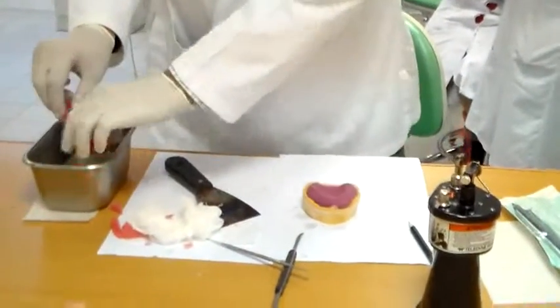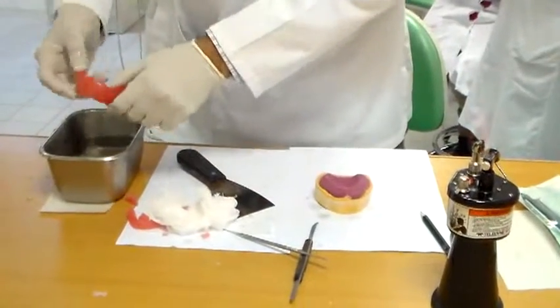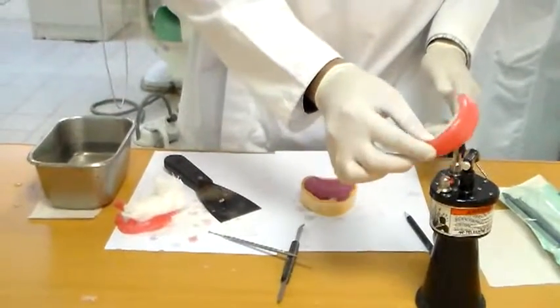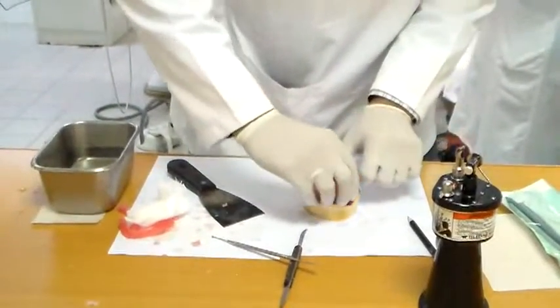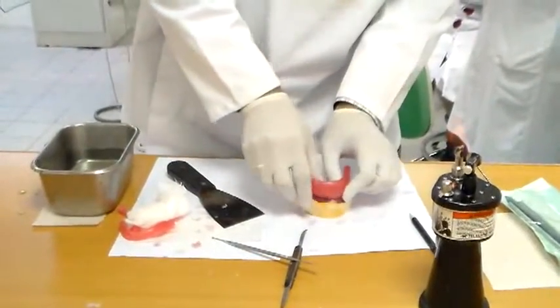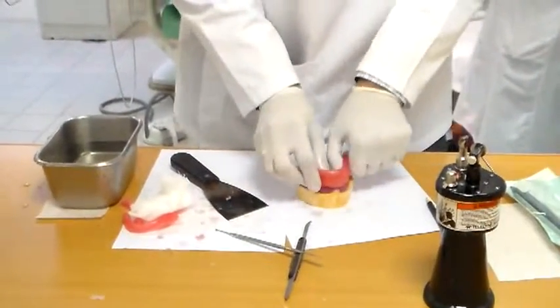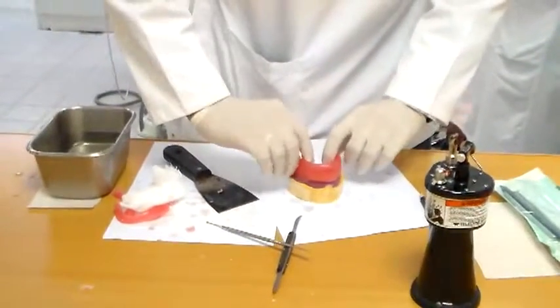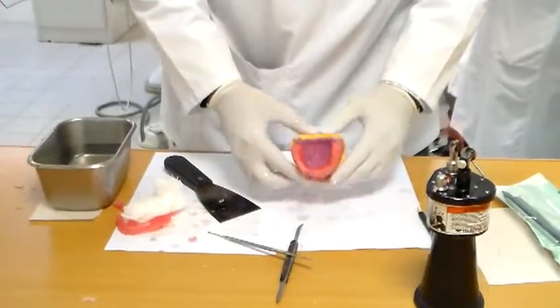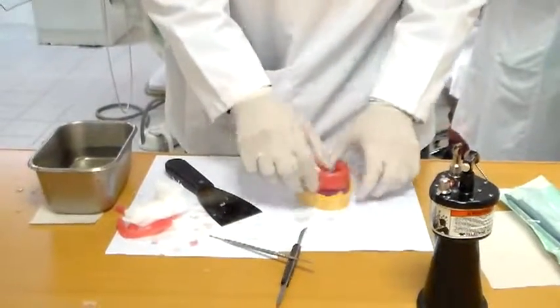Okay, so I have my occlusal rim reasonably softened out. Dry up the base, flame it a little bit, and adapt it to the anterior portion, to the outside part of the record base. Posterior portion can be onto the crest. Get a basic shape first, and then you can go on to develop the occlusal, the canine eminence, etc.